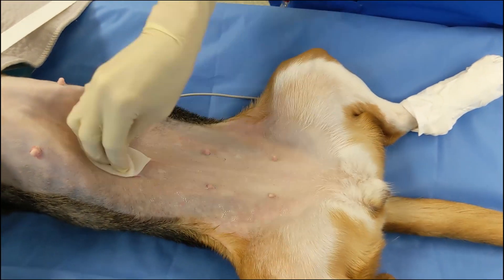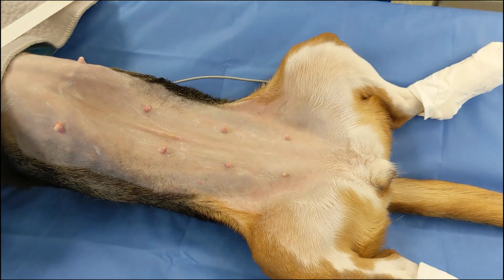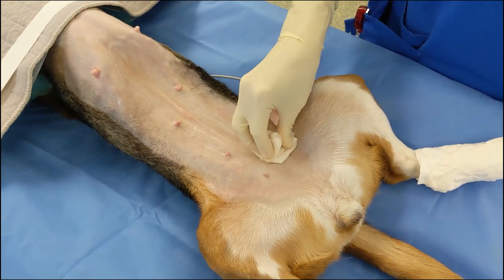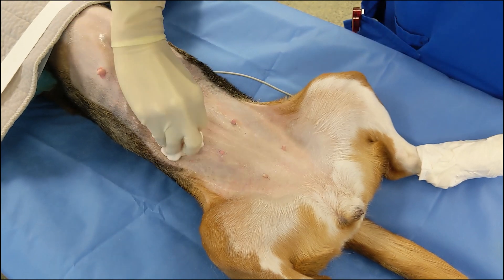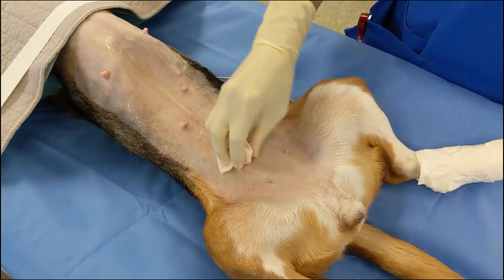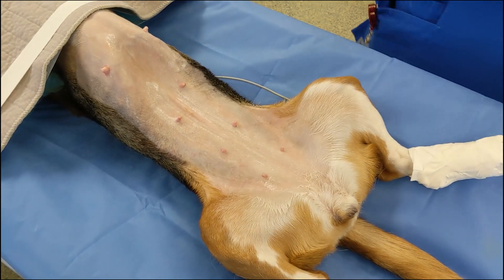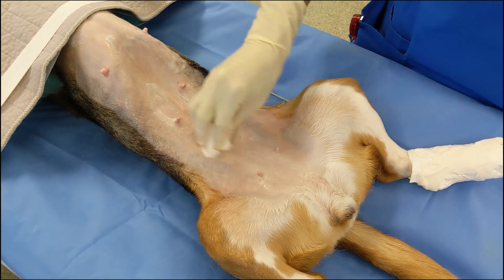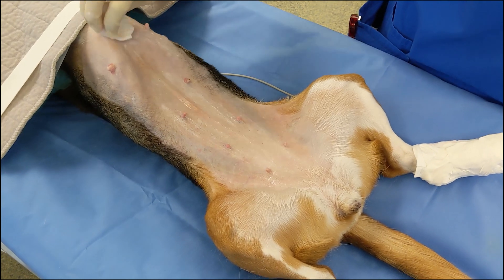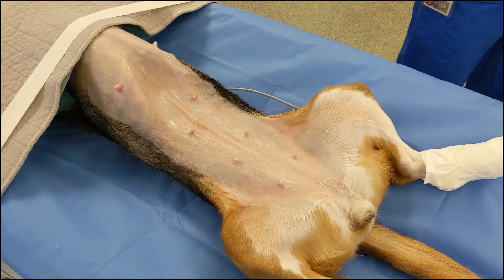When performing a sterile scrub, gauze should never drag from haired skin back towards the shaved and prepared area, as this will drag dirt and debris from the haired area back into the surgical site. Notice how once one edge of the gauze touches the haired skin, the gauze is rotated to keep that edge always in contact with the haired or dirtiest edge. If the gauze was not rotated, the edge that was in contact with the haired skin would be dragged right into the middle of your prepped site, bringing dirt, debris, and hair into the cleanest area.